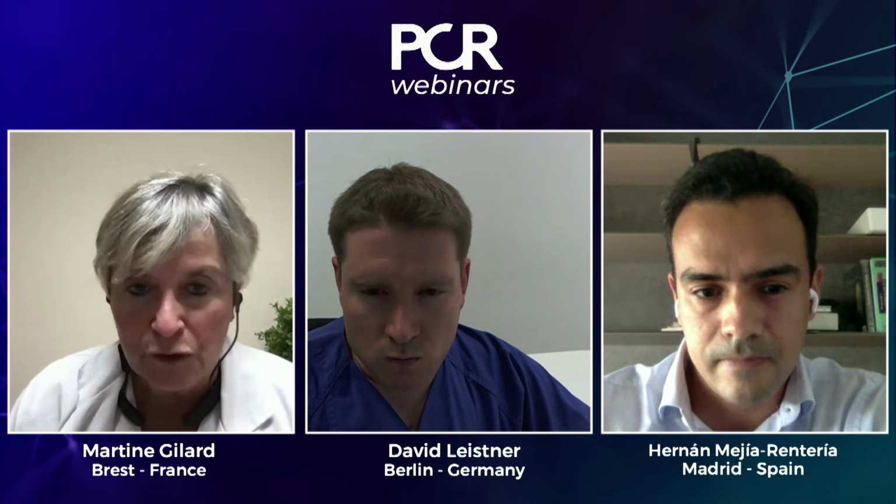one of the audience asked if we need an injector to perform the angio for the QFR, or can we do it by hand? Oh, that is a very good question.